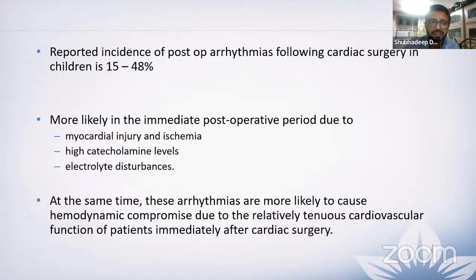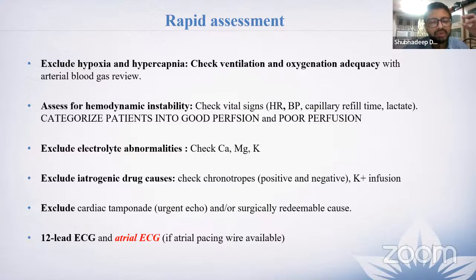So what are the rapid assessment goals? Whenever we come across an arrhythmia, first of all, I think as a resident, it's very important to identify that, yes, on this monitor, this does not look like a sinus rhythm. This looks like something else. That is something we have to get acquainted with. I don't expect all the residents in ICU to be familiar with all the rhythm disturbances, but at least we should have that clinical eye to recognize that no, this is not a sinus rhythm.